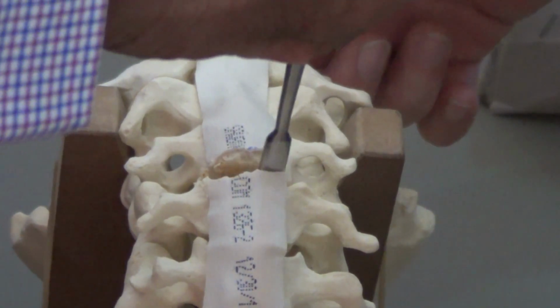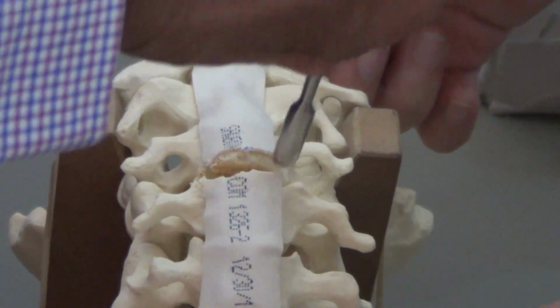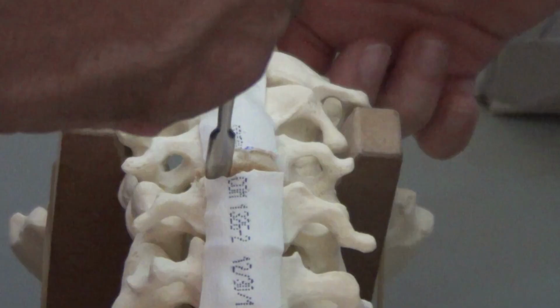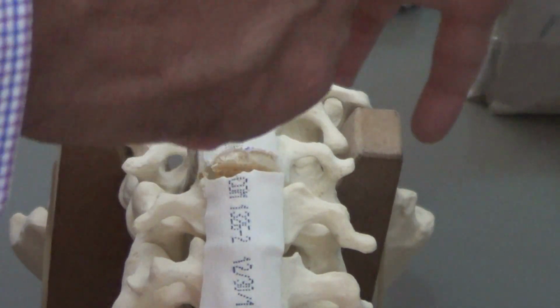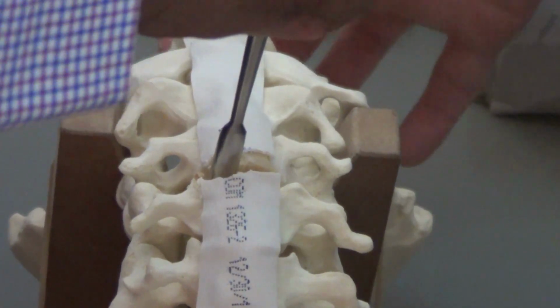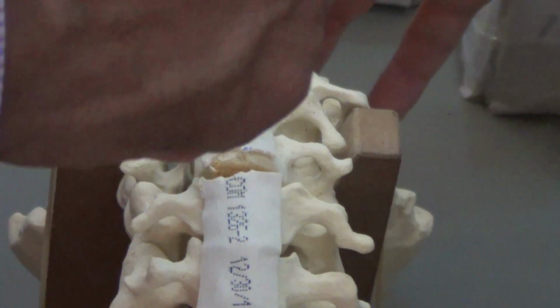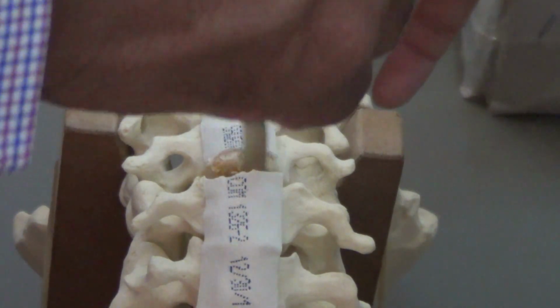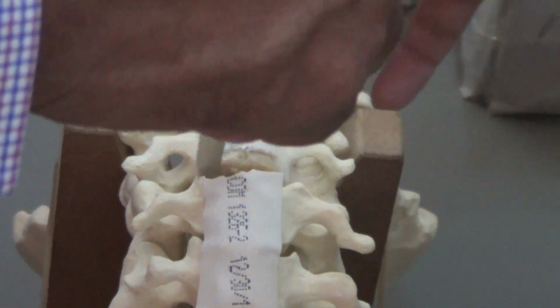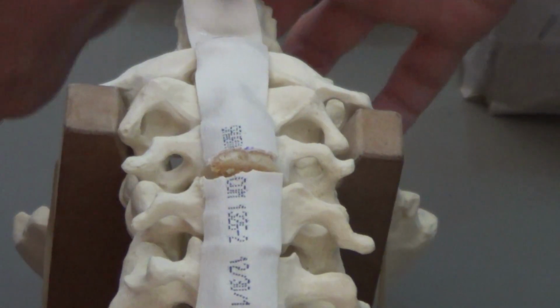You have to burr part of the uncinate process, but don't go lateral to the uncinate process. If you go too laterally, what is the vessel that is running there? The vertebral artery. So if you go lateral to the uncinate process, you are in danger of injuring the vertebral artery. So you burr and straighten so that you have a nice raw area, but do not take out the cortical bone till you come to the cancellous bone.